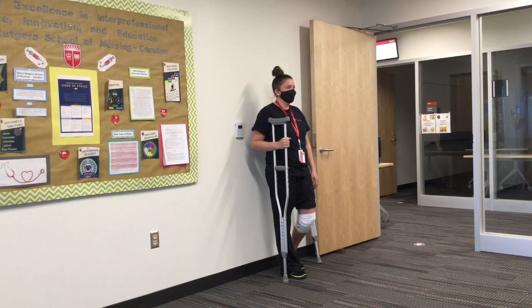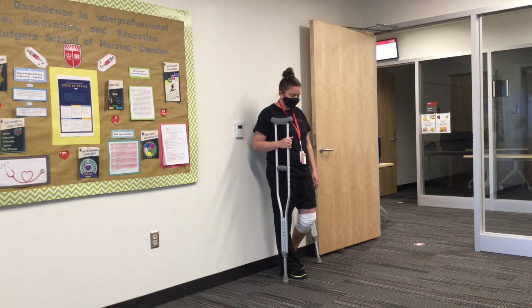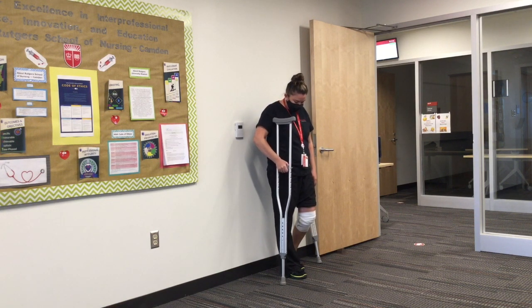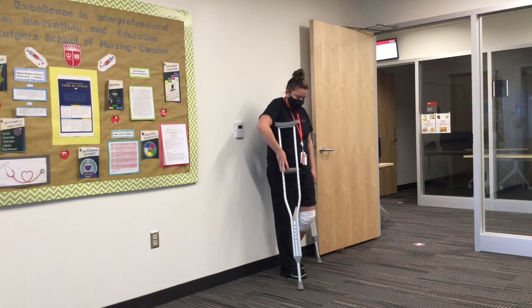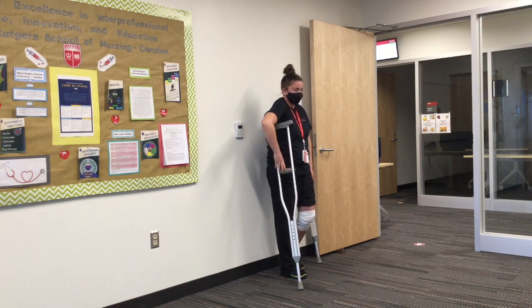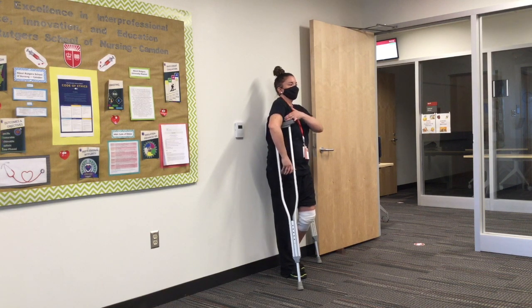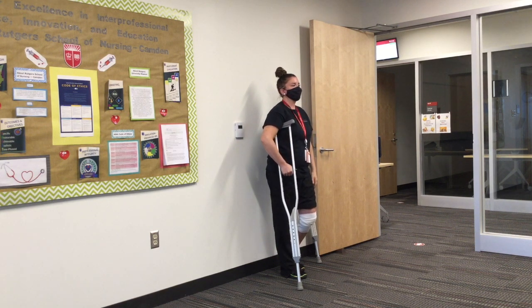While standing next to the patient, have the patient take the crutch 6 inches from their foot to the right and 6 inches in front of the foot. Have the crutch lean against the patient's side with the crutch pad being 3 finger depths away from the axilla. The elbow should be positioned with a flex of 15 to 20 degrees.